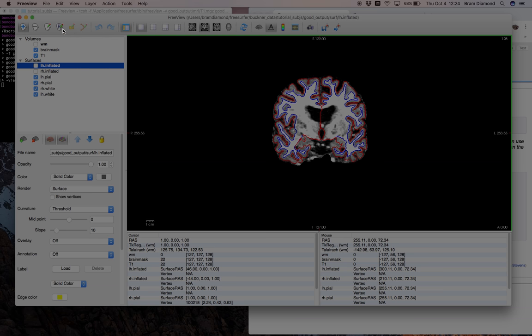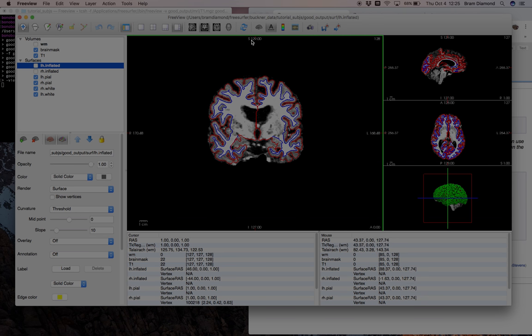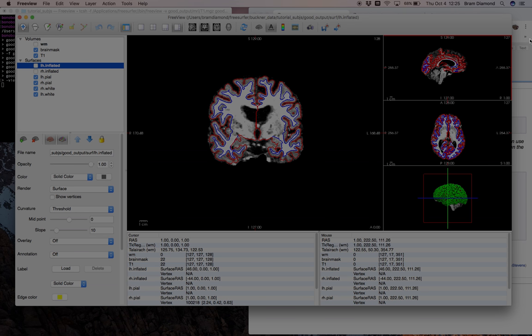There are four layout options which will allow you to view the brain from multiple orientations at the same time, or multi-pane. You can change to the fourth layout to see the coronal, sagittal, axial, and 3D images simultaneously — here we have the coronal, sagittal, axial, and three-dimensional planes.